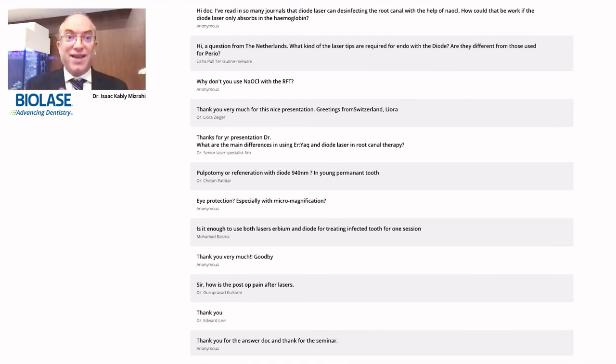And if you combine your radial firing tip with sodium hypochlorite, it will work. It won't work because the laser changes something in the sodium hypochlorite, as stated in other parts. It will work because of the biological interaction it has with the surrounding tissues, and because it will make a cavitation effect with an irrigant whose characteristics we know.